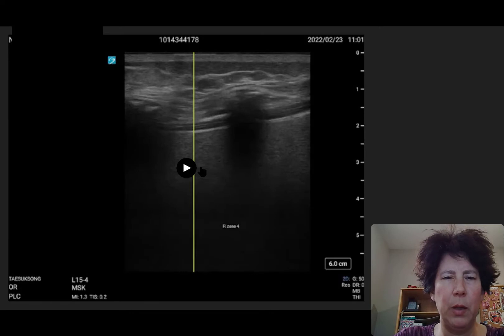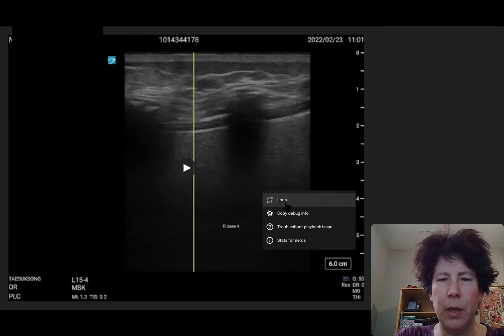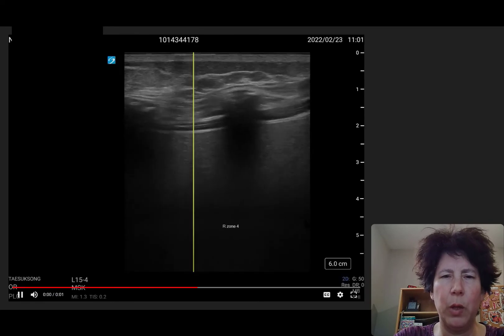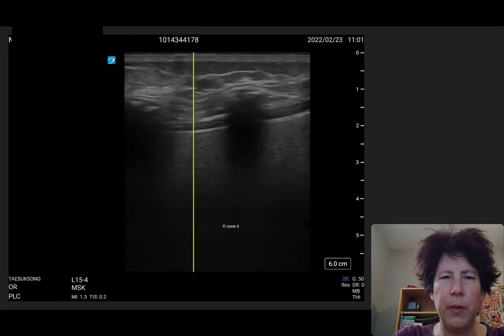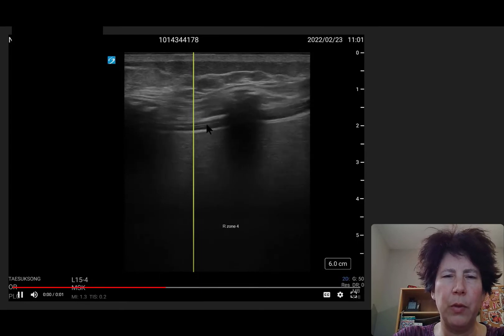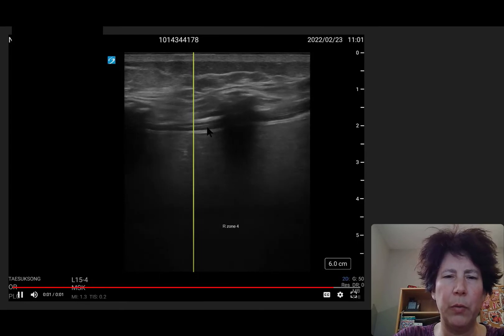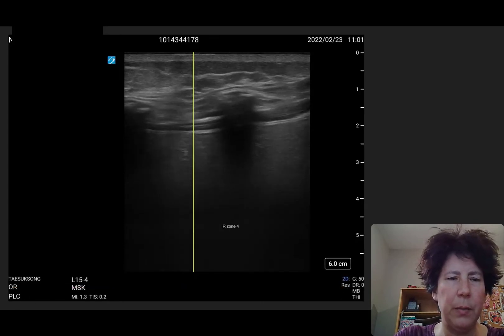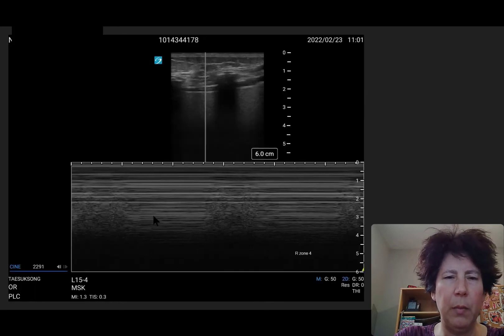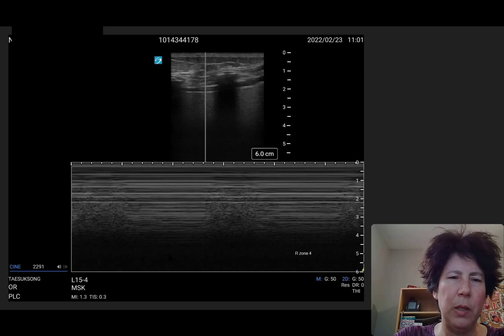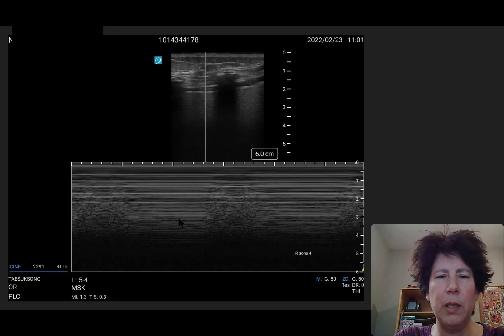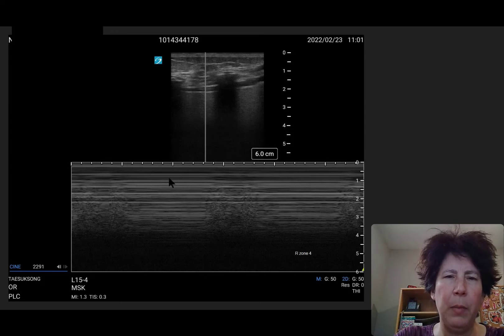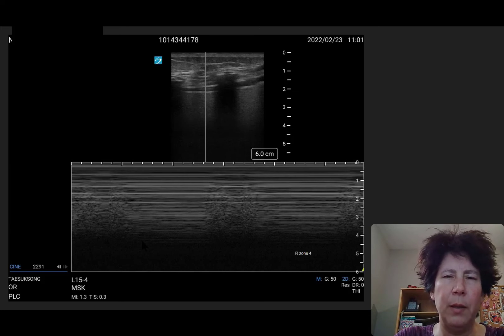Lower down on the lung, so this is now zone 4, we see very little movement. There are clear pleural effusions with separation of the visceral and parietal pleura, and fluid with this almost tissue-like lung just sitting below it. In M-mode, at times it looks like a lung point and then at times it doesn't. I think it's not a true lung point between pneumothorax and normal — I think this is collapsed lung with pleural effusion and more normal lung.